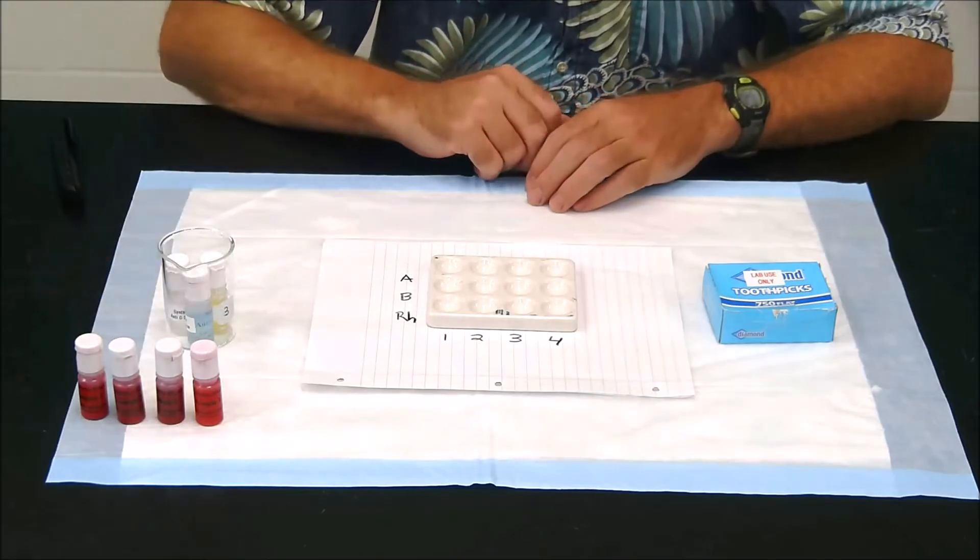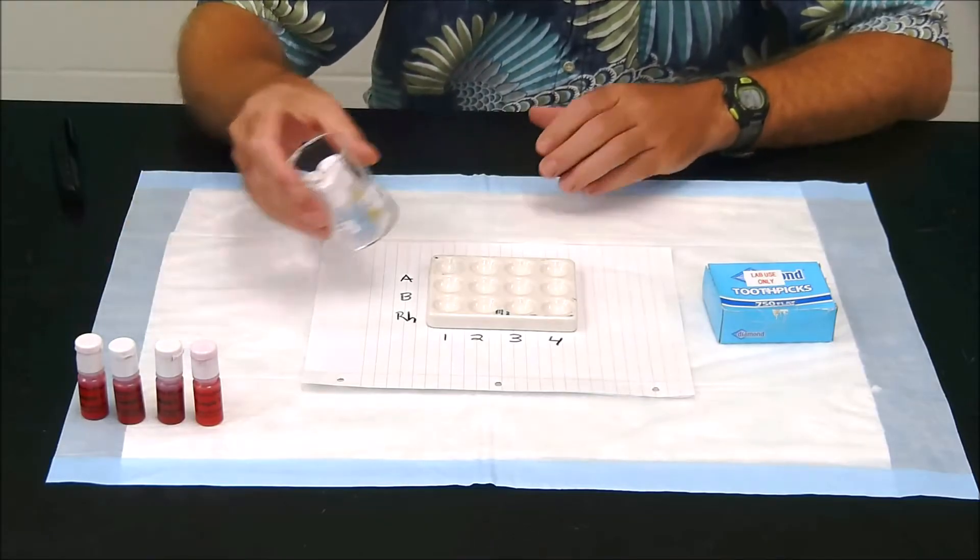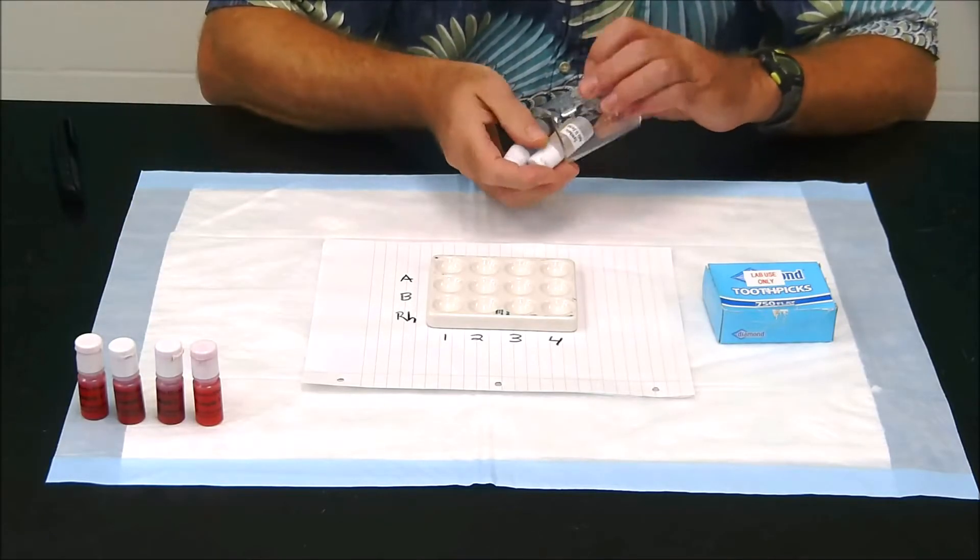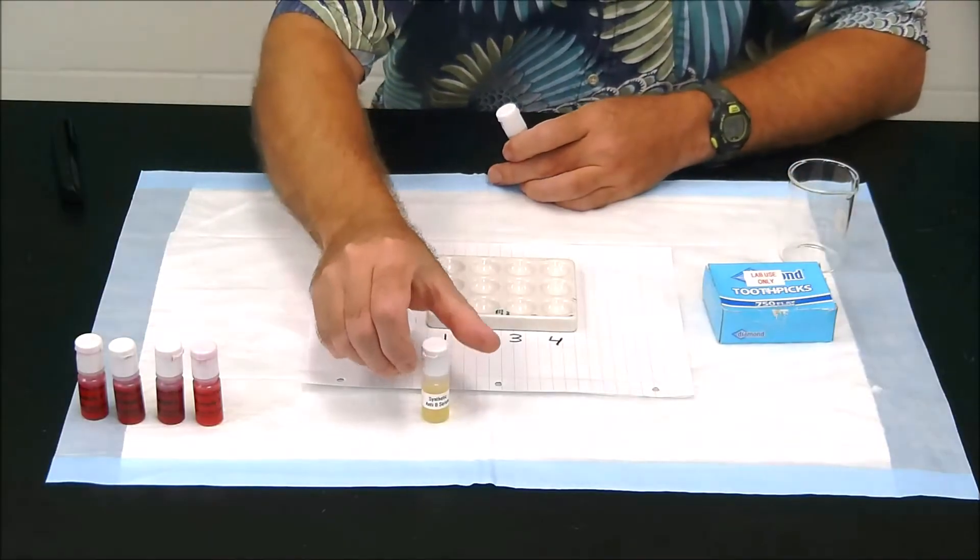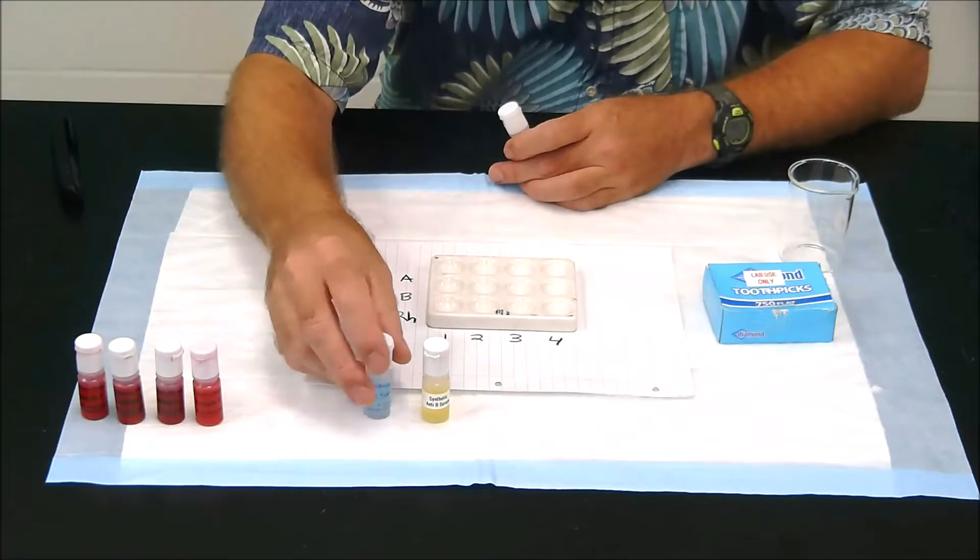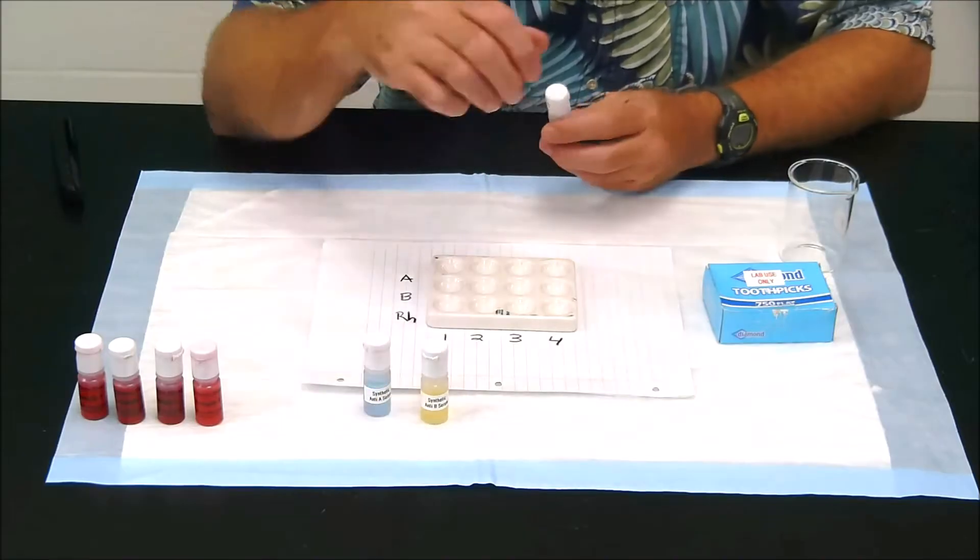You'll also need the three anti-sera, and these are essentially like antibodies. So we have anti-A, anti-B, and something called anti-D, which is anti-Rh.